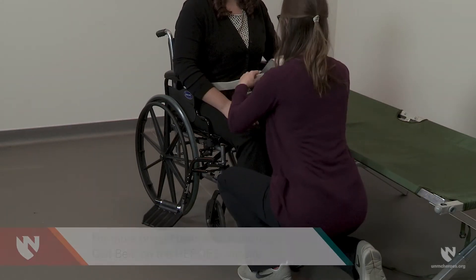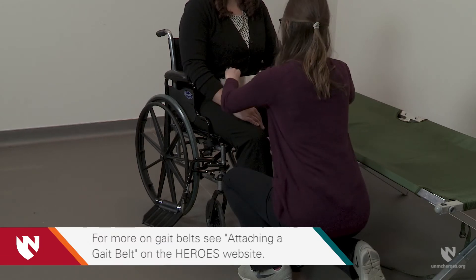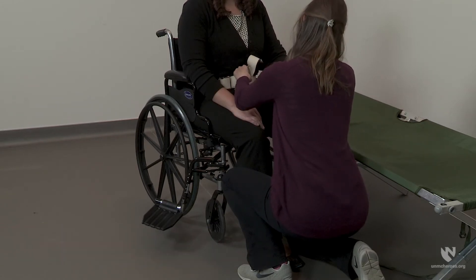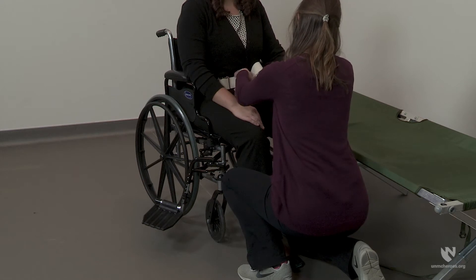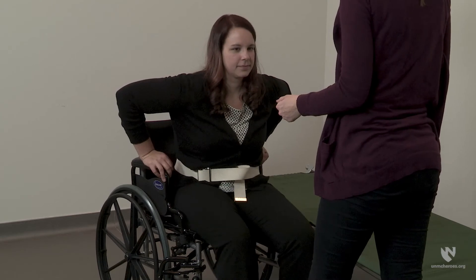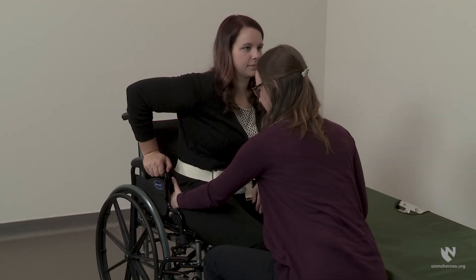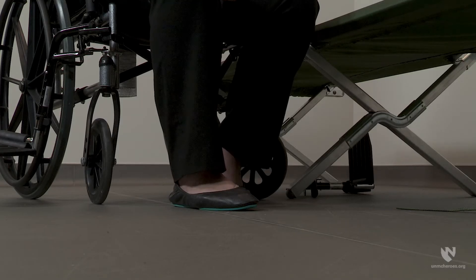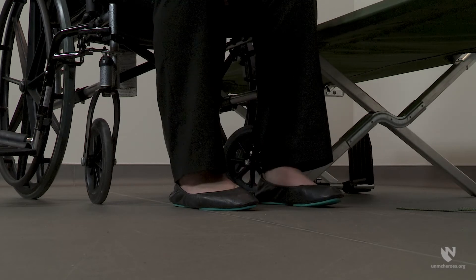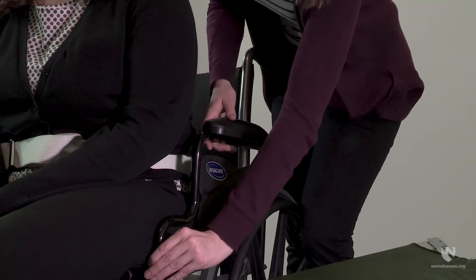Fasten a gait belt low and tight around the individual's waist. Ask the individual to scoot forward in the wheelchair using the armrest for support. Provide assistance at her hips if needed. When the individual is positioned at the front of the seat, ask them to make sure their feet are placed flat on the ground. Swing away or remove the armrest from the side closest to the cot.